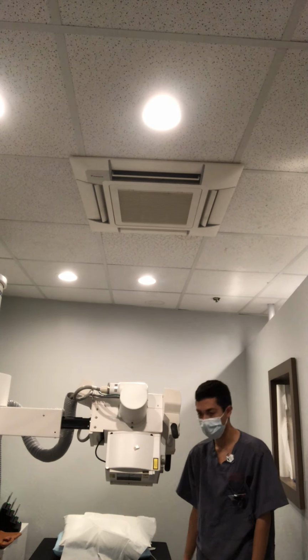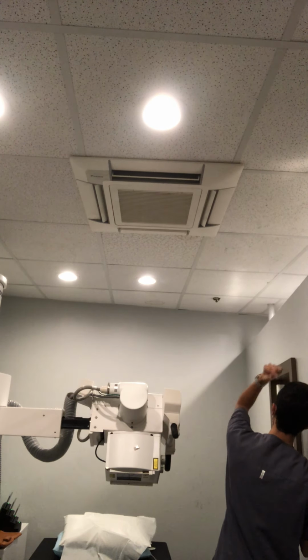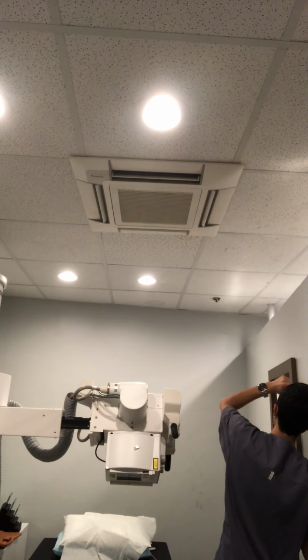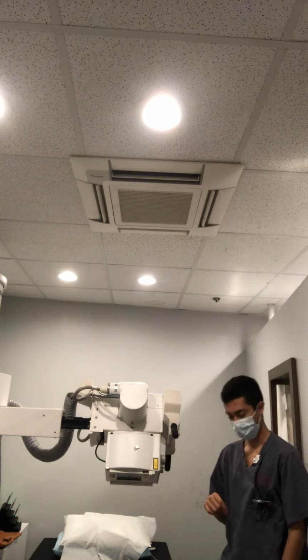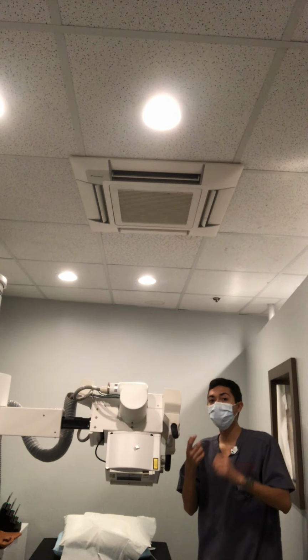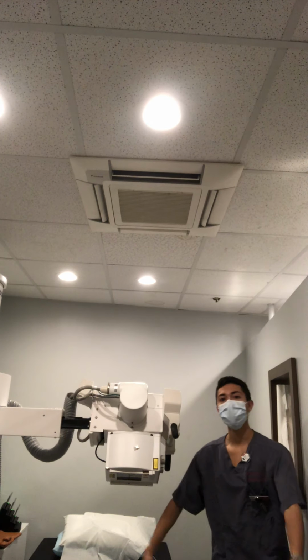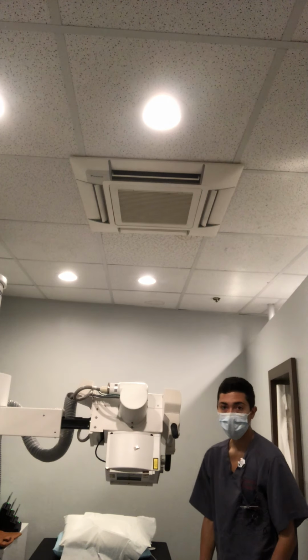Markers, recommended placement. So when the patient's like that, you would put the marker like over here. So you would be near the skull, away from the anatomy. You don't want it in the anatomy. It's very important because you're trying to get a small structure. So, by putting the wrong placement of the marker, you can get it on the anatomy, then you got to repeat the exposure, and that's more radiation to the patient that we don't want.